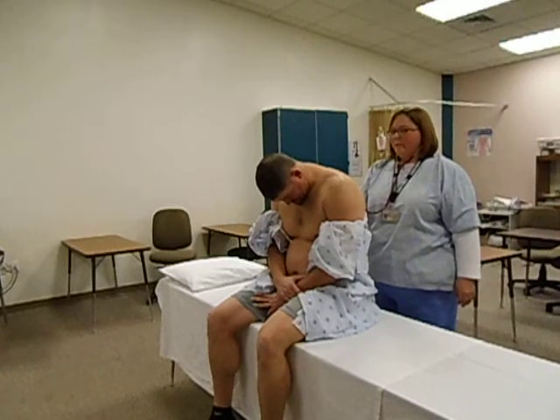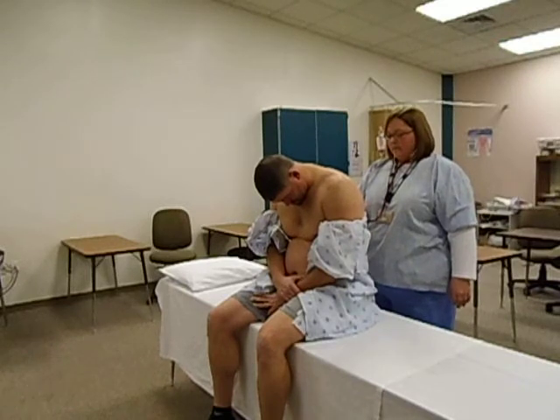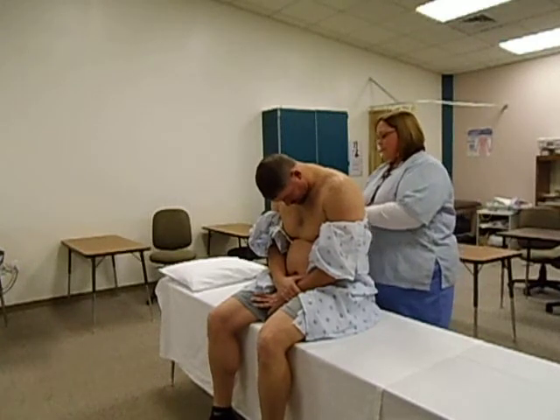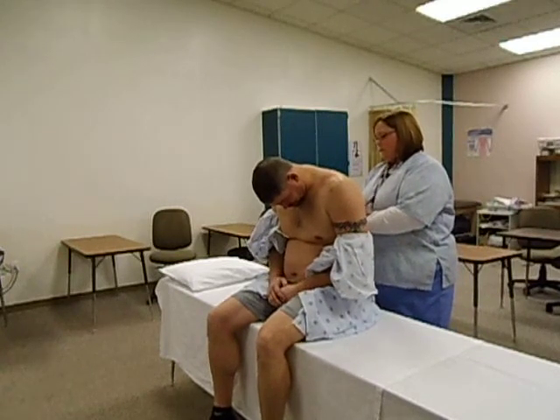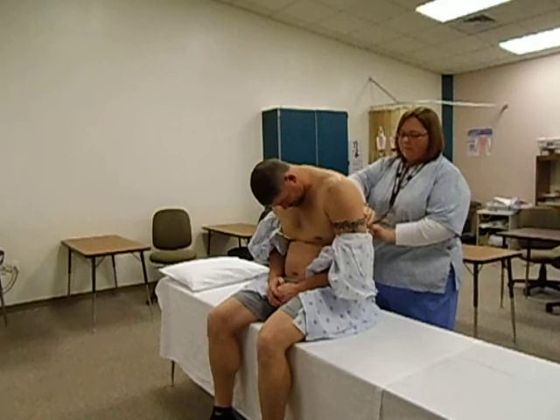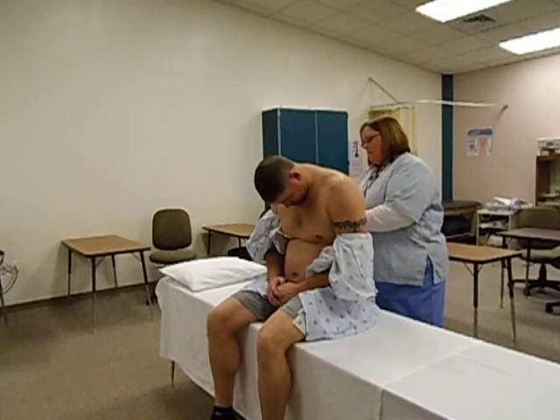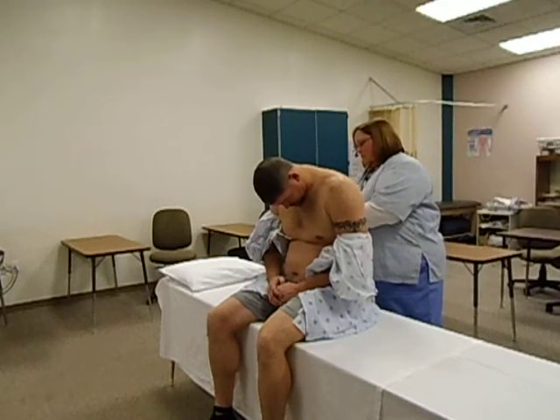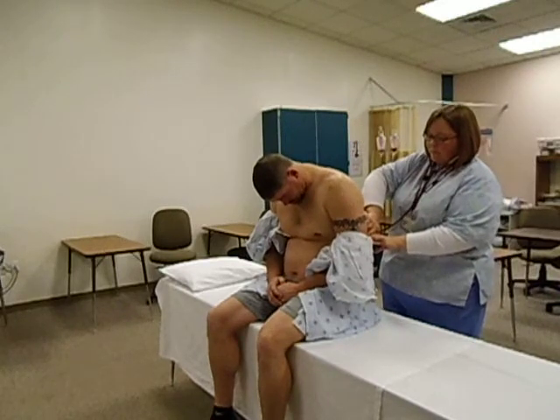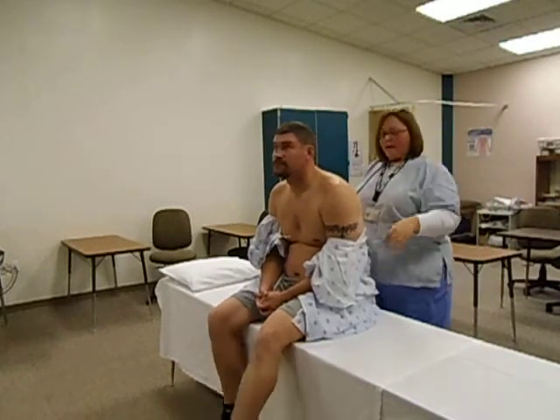Make sure not to listen over the scapular area. The breath sounds are clear in all lobes.